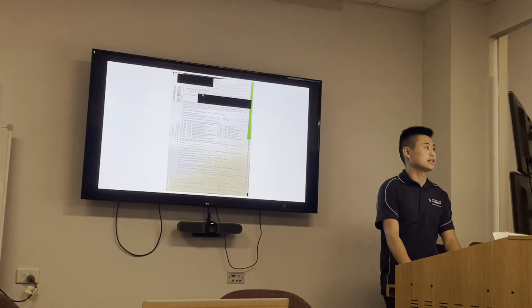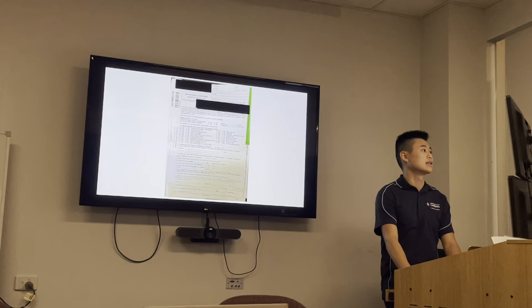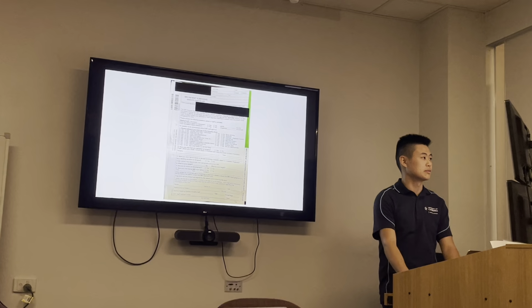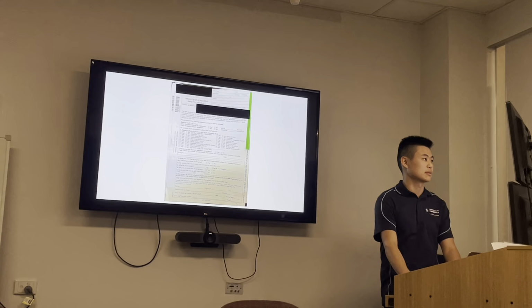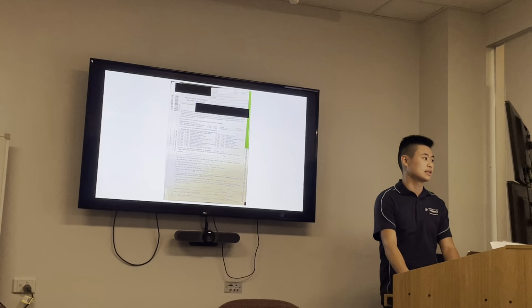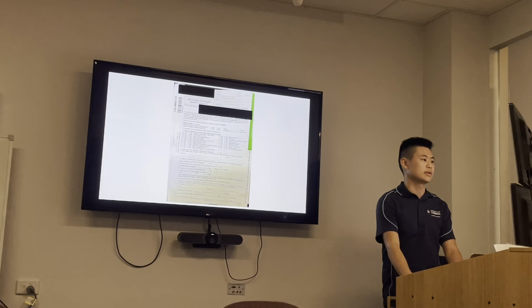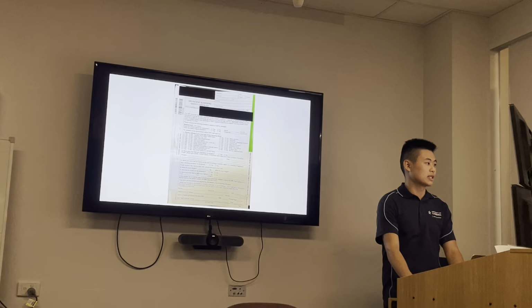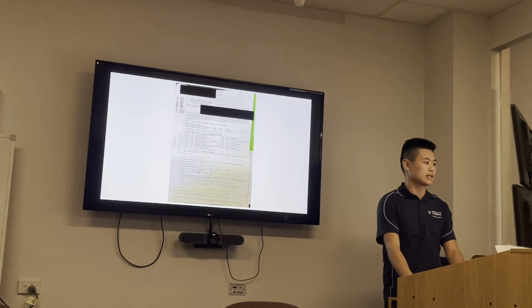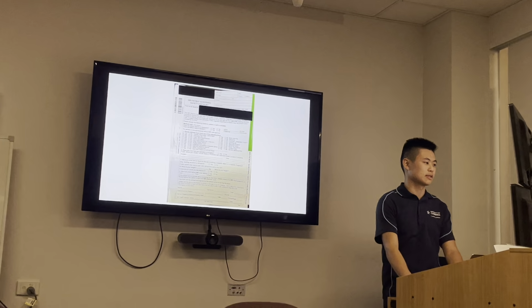So this is the MRI screening safety checklist that's given to basically all patients that enter the MRI machine. So they fill out the name, everything, and the majority of this you would have to cover: cardiac pacemakers, aneurysm clips, any sort of electronics or implants inside the body, previous surgeries, any injuries to the eye involving metallic fragments, pregnancy, if they had the scan before, and getting this signed off by the patient or the delegate and the doctor or staff.